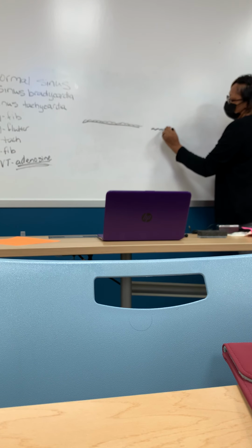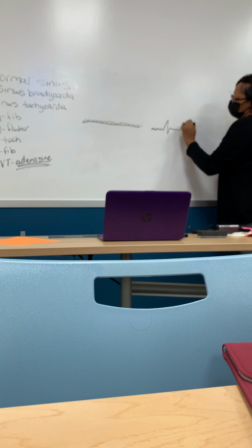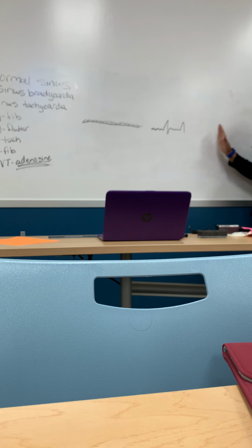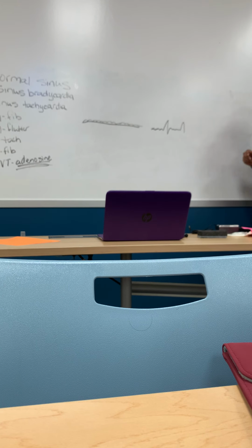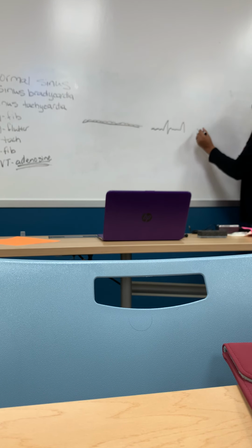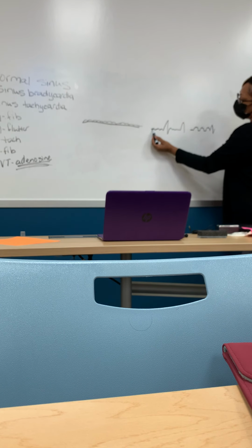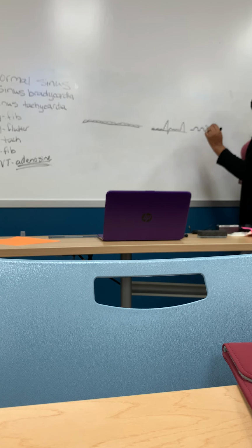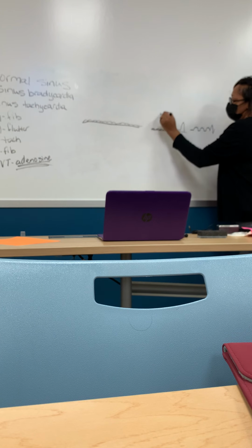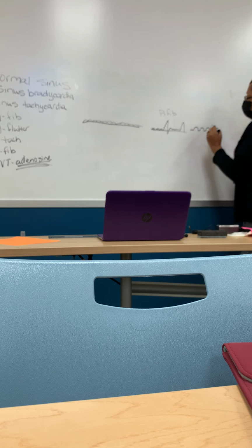Can you find your P's? No. AFib? Can you explain why the second one is AFib? Because those are flutter waves. This one is AFib. Why?